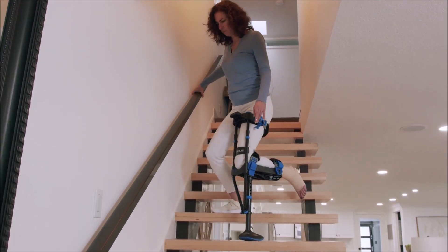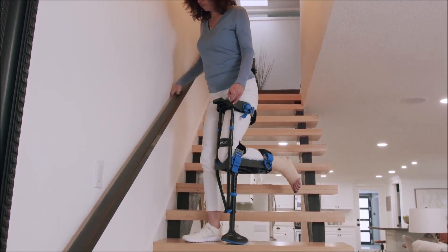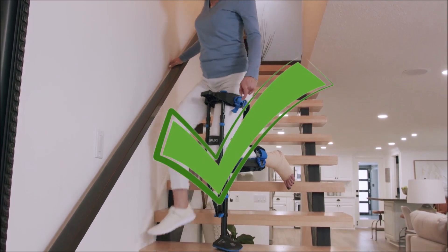An alternative method is to descend facing forward. This method only works if the handrail is on the opposite side of your iWALK leg.